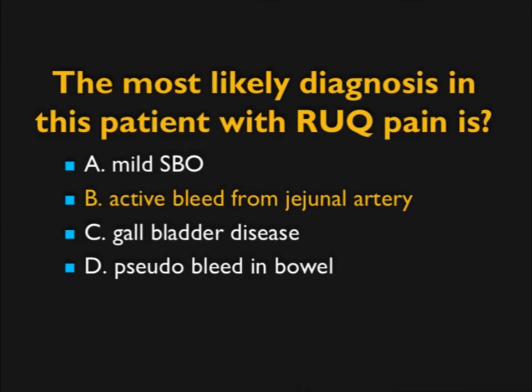CT is excellent for detecting bleeds, particularly small bowel and large bowel. The key is the protocol: fast injection, fast acquisition, dual phase imaging, and no positive oral contrast material given.